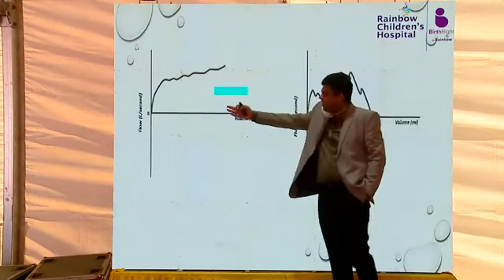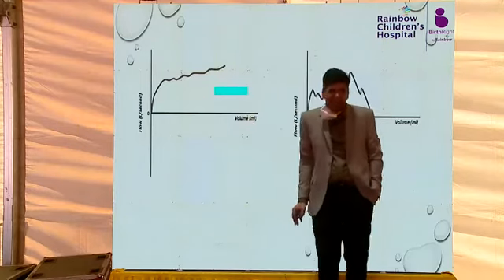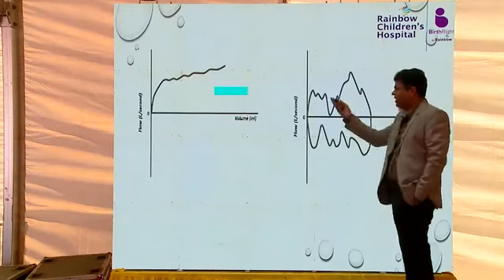Okay. Again now inspiration, the flow is here, it's not coming back here. What is happening? Sorry, tube out. Very good. So it's expiration.